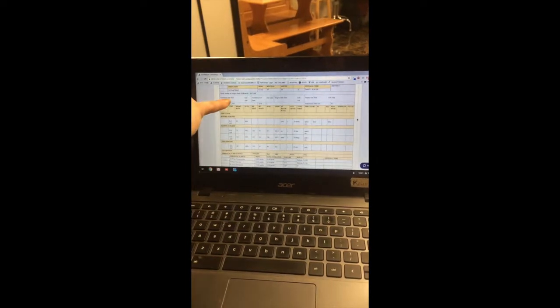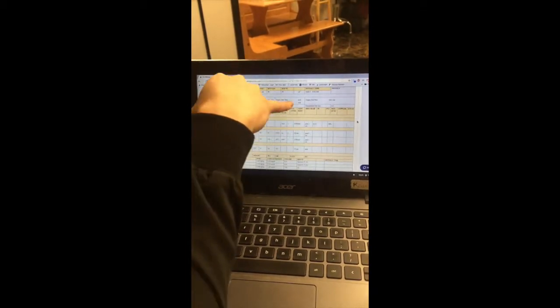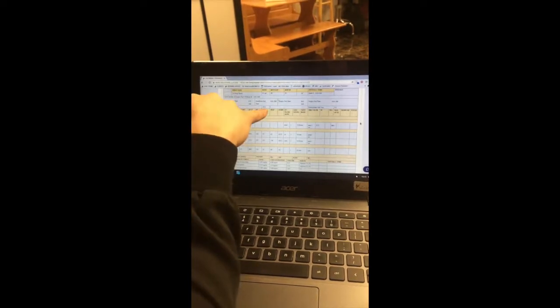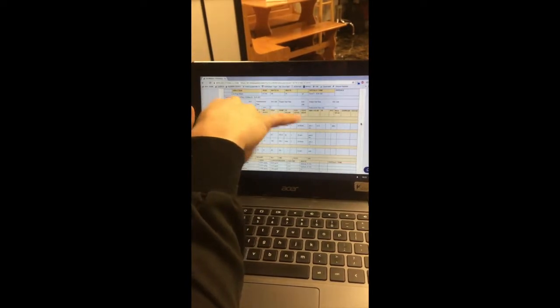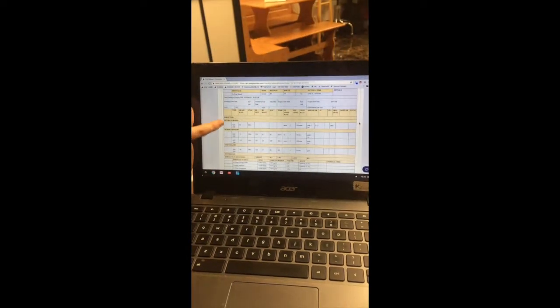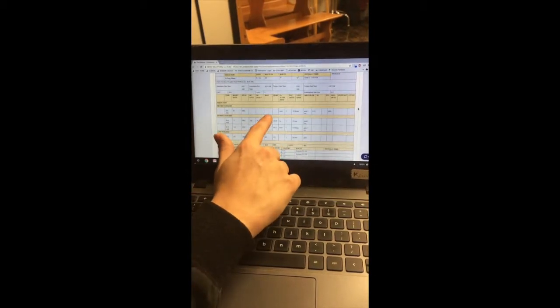We have the anesthesia start time, the anesthesia end time, the surgery start time, and the surgery end time. She was given ISO gas. Her ASA rating was a 1, and we record the size of her endotracheal tube. We also have all the numbers that we recorded for the length of her procedure. So we have the time that it was recorded, her heart rate, and her SpO2. Initially, we didn't have her hooked up to a blood pressure machine.